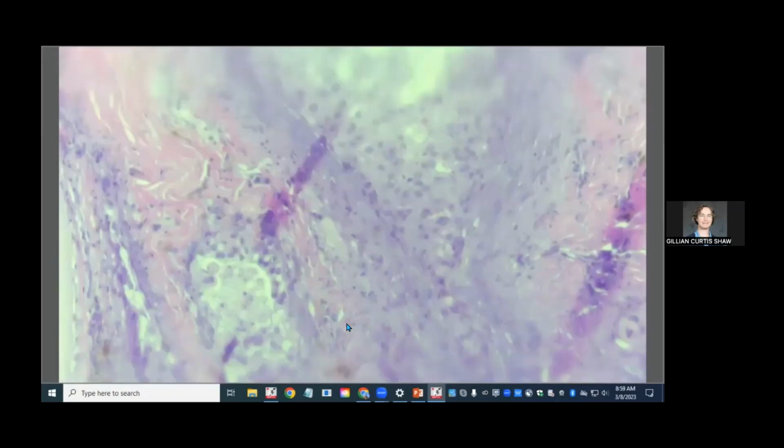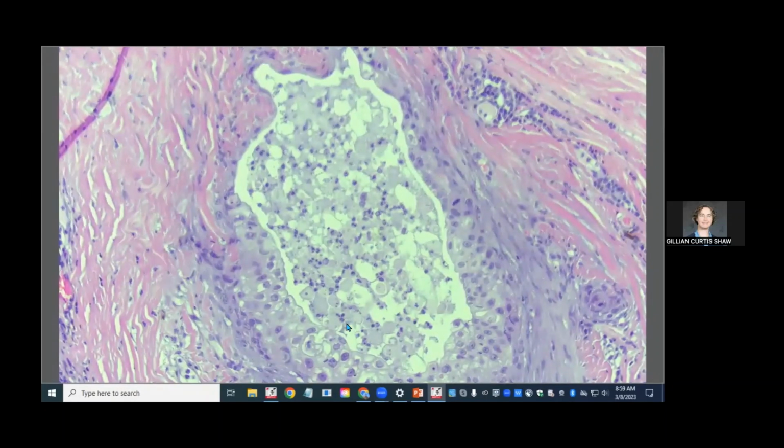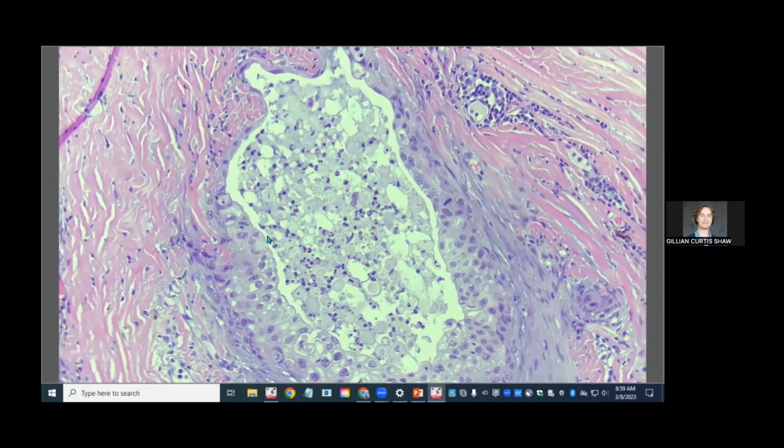If we look at the cells more closely, they do some really beautiful things. So these are neoplastic epithelial cells. Some of the spaces that they're lining are actually blood vessels, so they're coating the endothelium of these blood vessels. I don't think this one is necessarily a blood vessel, but some of these spaces are. These cells have a lot of mitotic figures, a lot of atypia. They slowly progress and don't mature in any orderly way, but there are some places where they keratinize. And in the center of these spaces, there's a lot of cellular debris with neutrophils and sloughing necrotic neoplastic cells.